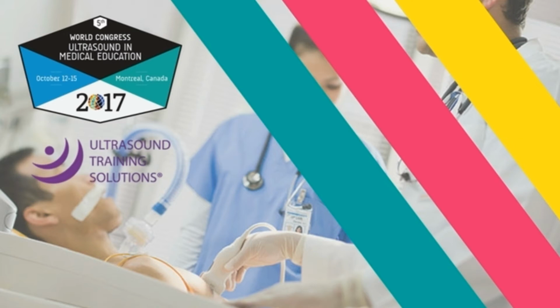So they're very useful at the beginning of teaching to start to get that spatial awareness happening. But I haven't seen a simulator yet that truly replicates the wide variability that's out there in the real population. You know, there's a pelvic simulator that's got a perfect anteverted uterus, and then you get out into the real world. Some are retroverted, some bend off to the side, some have got more gas in front of them than the simulators can ever pretend to mimic.